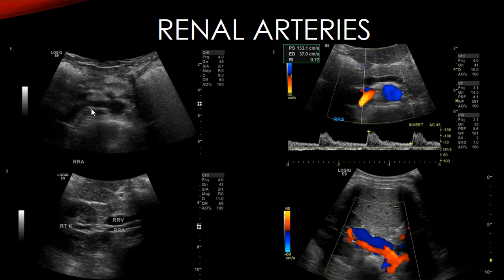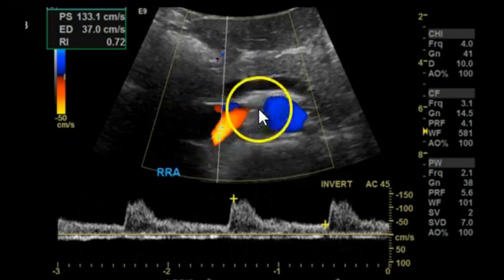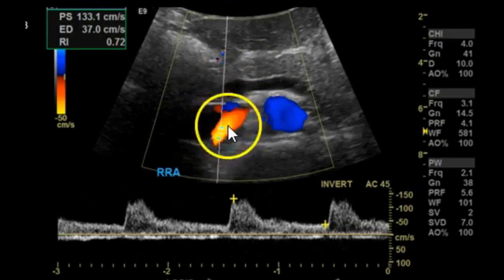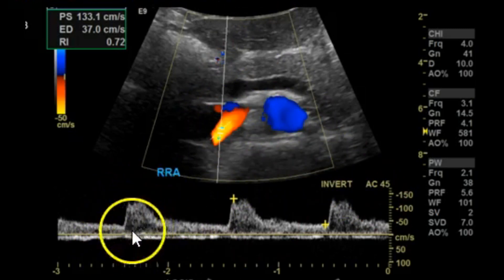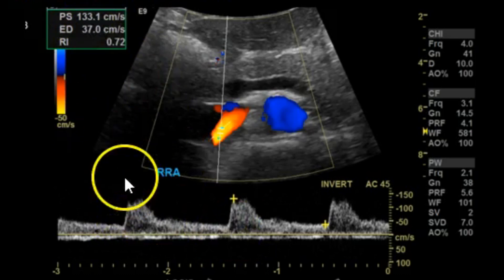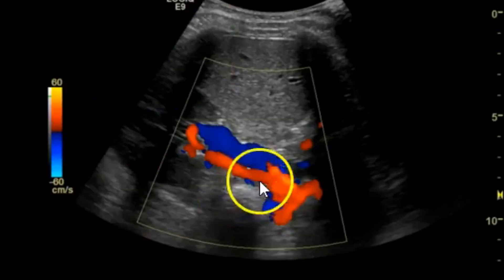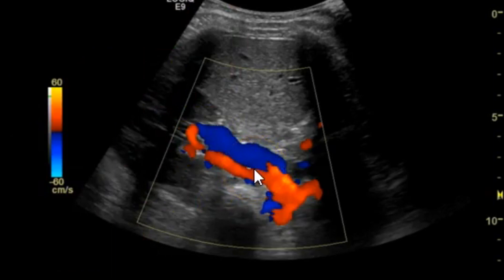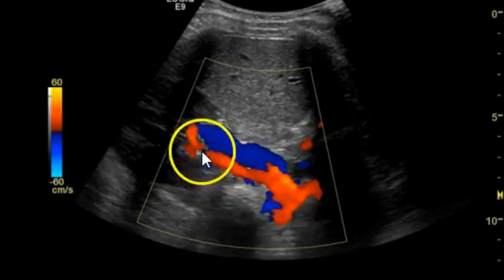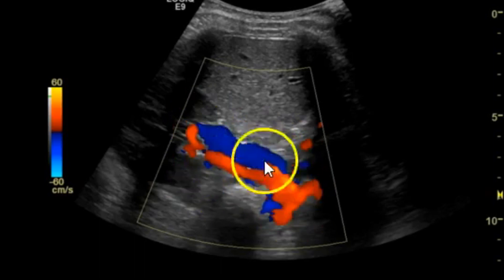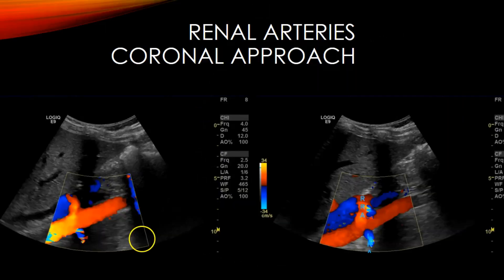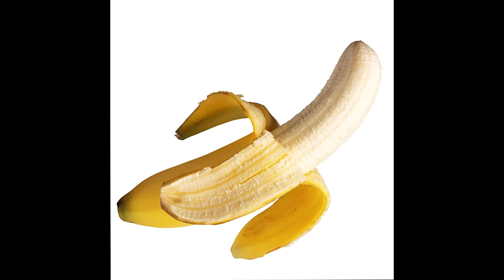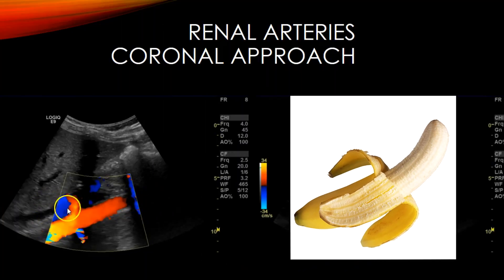When scanning anteriorly, angle your transducer to get an appropriate Doppler angle — at 90 degrees to the beam you'll get no signal. At approximately 45 degrees you get a nice clean spectral waveform with a sharp upstroke at 133 centimeters per second. Angling more to the left, you can see the artery and vein in longitudinal, and then at the hilum you have the right renal vein and right renal artery.